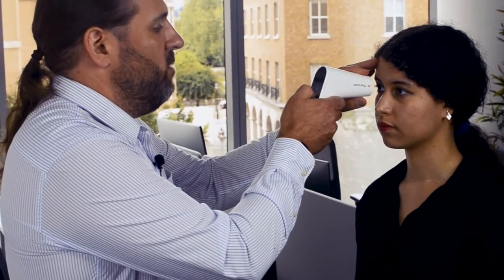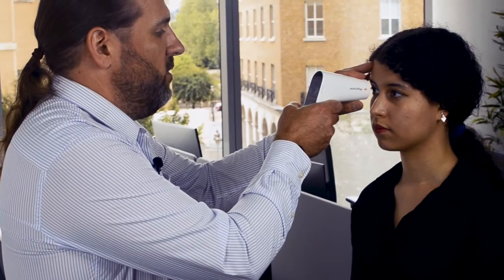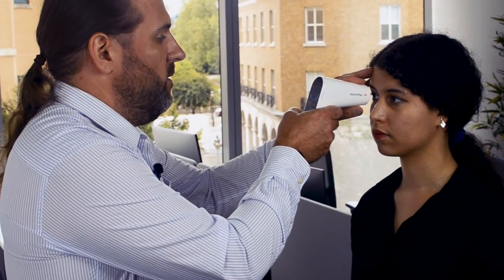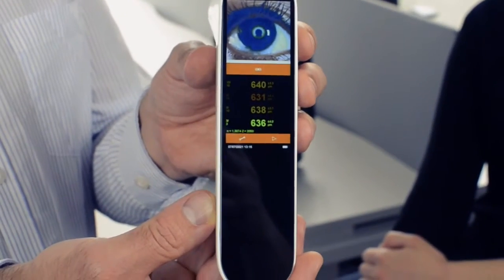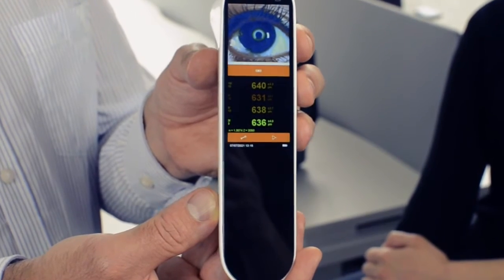You can then go on to take further measurements to give confidence in the measurement results. After two, three measurements, in this case we've got an average thickness of 636 microns with a standard error of 4 microns.